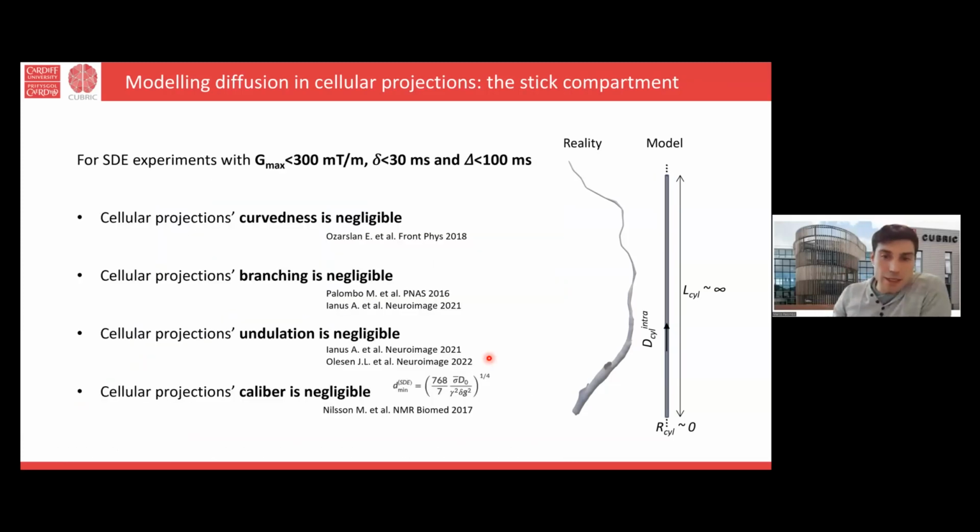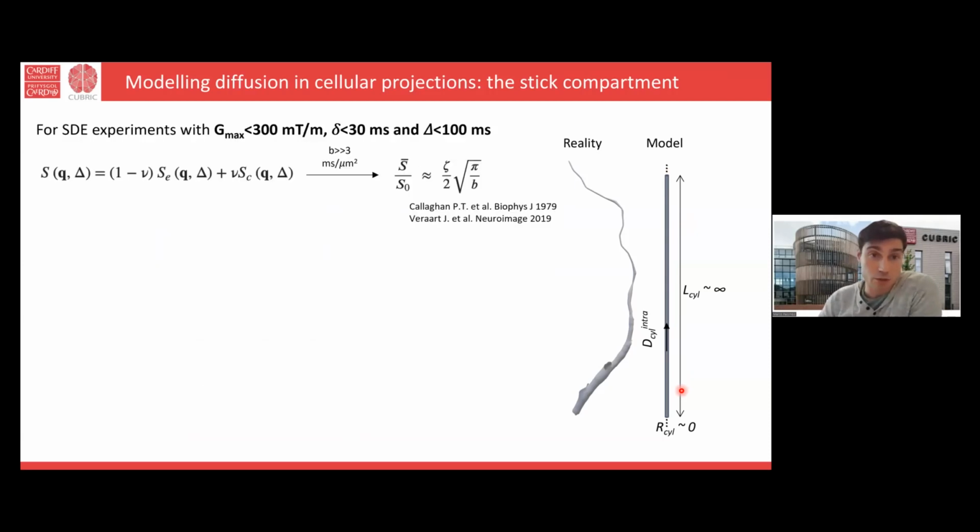So we can also say what happens if you do not have access to a powerful scanner, if you work on a more clinical scanner or below, let's say, the connectome, if we keep the connectome as a reference for human acquisition. If you work in that regime, of course, you lose sensitivity to the diameter of the fiber. And so you move from modeling fibers as cylinders to modeling fibers as sticks, that Ricardo already explained in the previous talk.